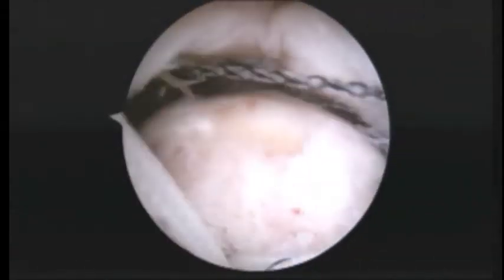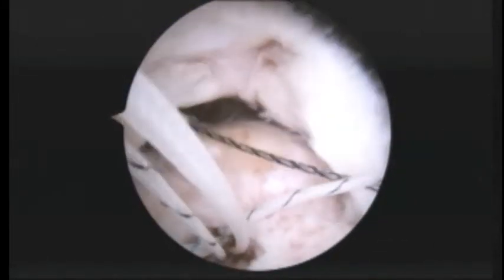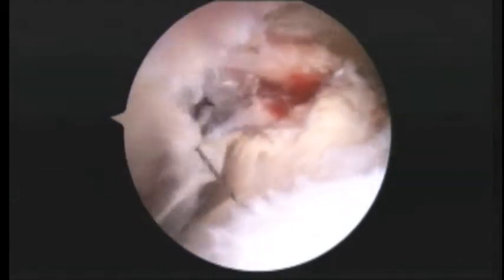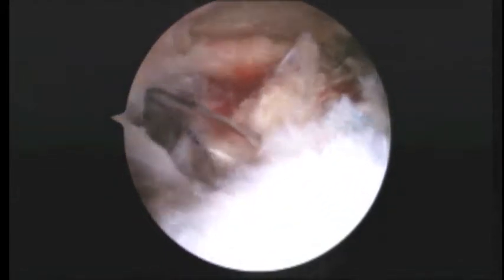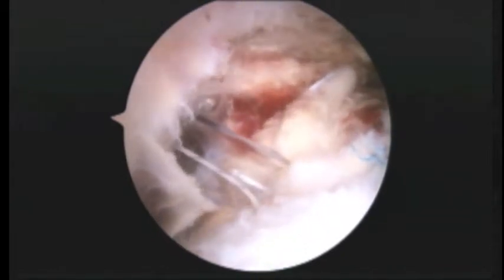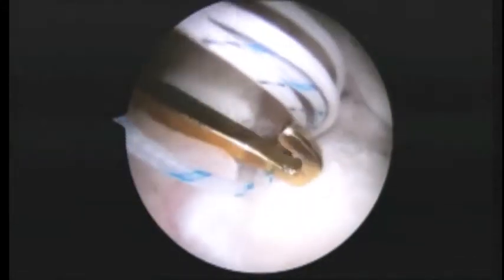Okay, so we've got our first stitch all the way underneath the rotator cuff. And as we pull back, you'll see that black and white suture right there. And it's going to, hold the camera there, please. It's going to come out right through the cannula there. That's just exactly what we want it to do. And next we'll reach in and get the partner black and white suture right here.